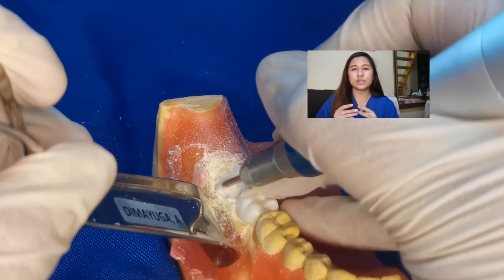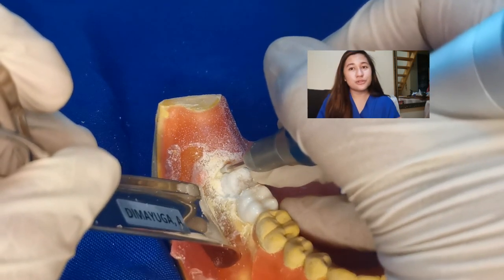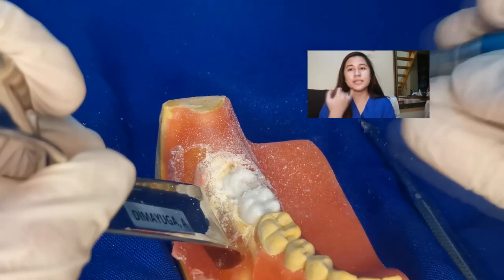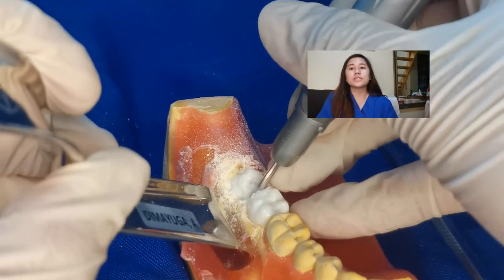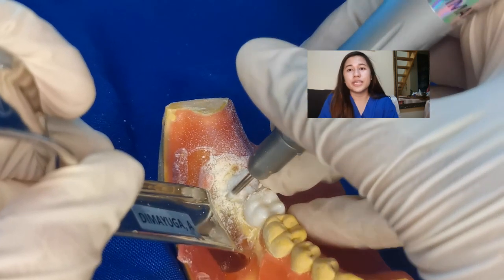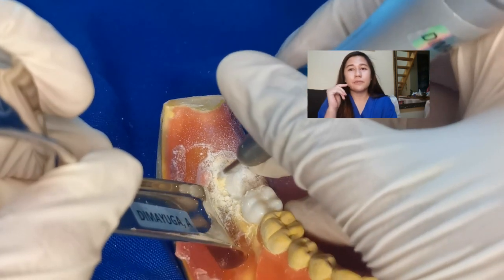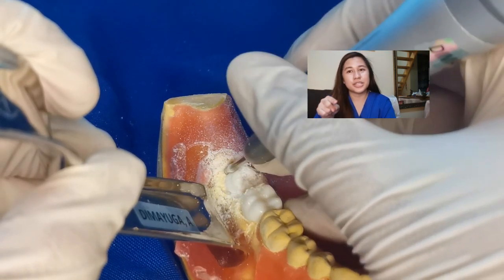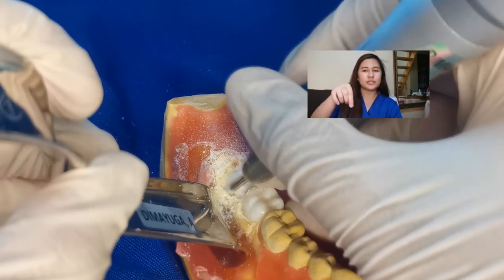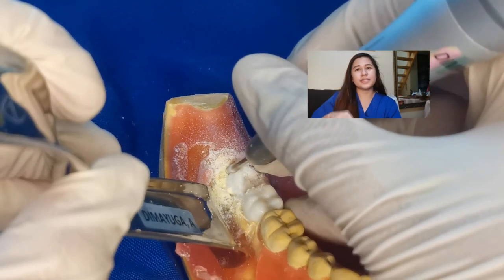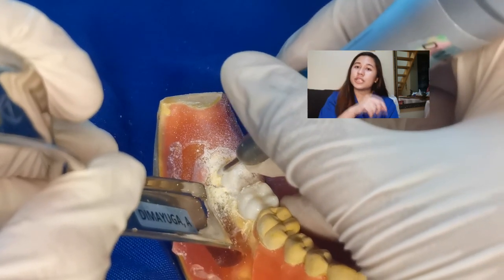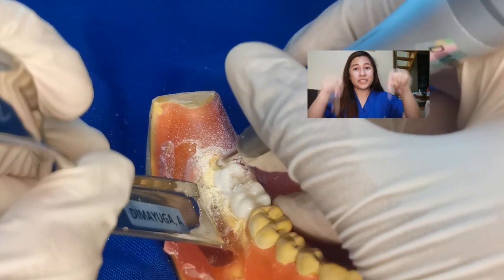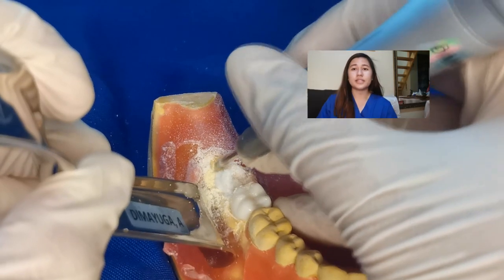We will start by making our displacement space and our working space. Right now I am drilling using my surgical bur — it's a round bur. I'm drilling on the mesial making my working space, and then I'm drilling on the distal working on my displacement space. Once the depth is enough, you'll be connecting the two holes, or drilling until you reach the cervical.